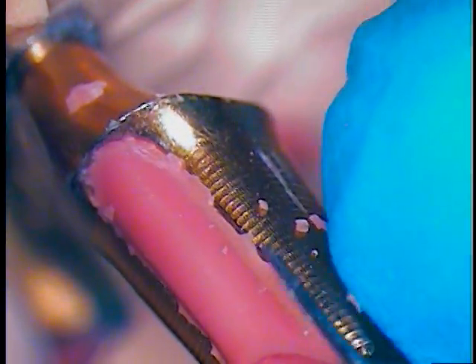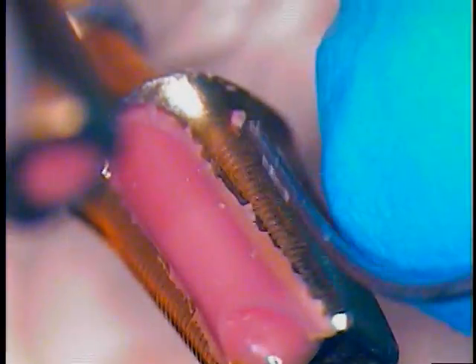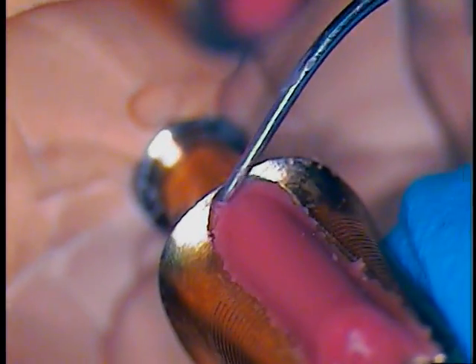So I just took an explorer and I'm going to verify the fit with the jig again. I'll just dry that ever so lightly with a little bit of air. So we'll get a nice seal that will continue all the way around, even into this area. We don't want any bacteria down in here. But we're so close to the screw vent hole — we're talking maybe a couple tenths of a millimeter, if that, from the mesial. So we have to leave that on there. That will be filled with cement.